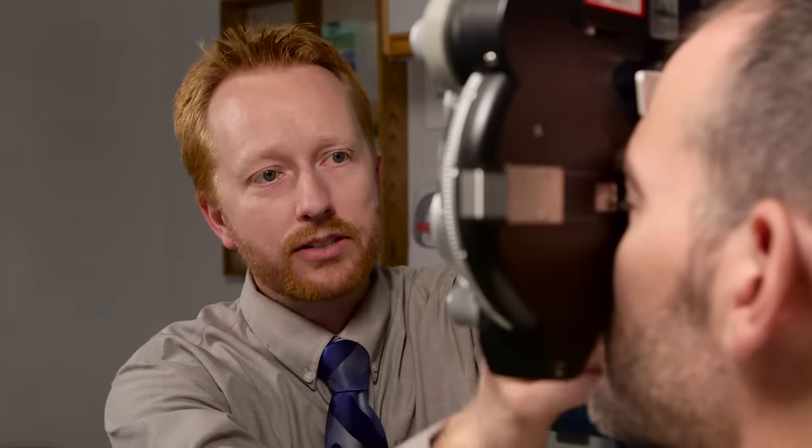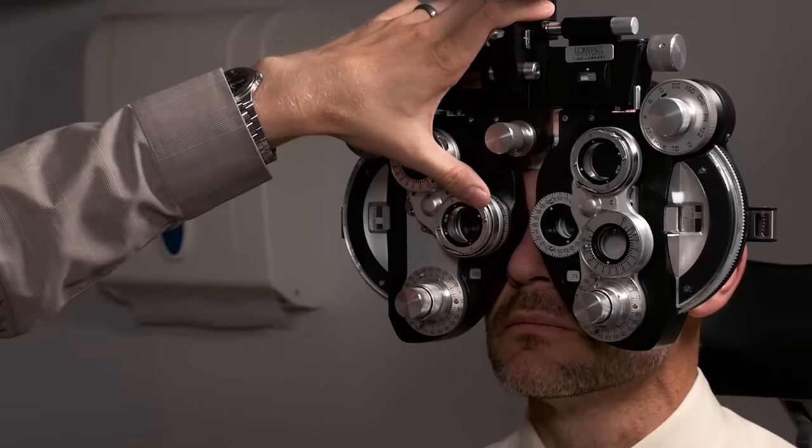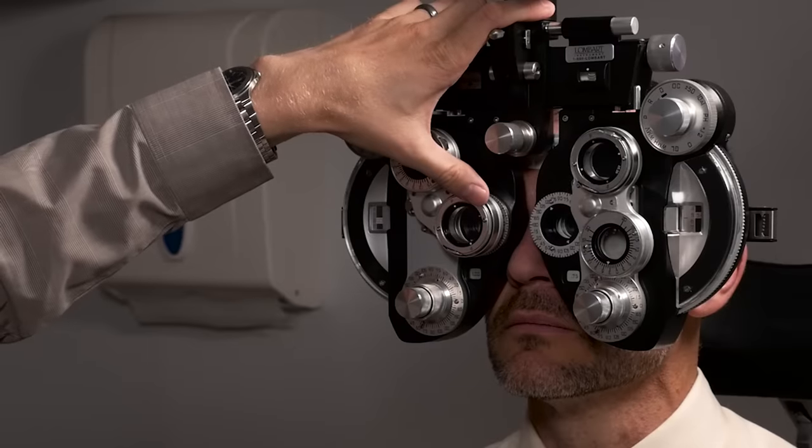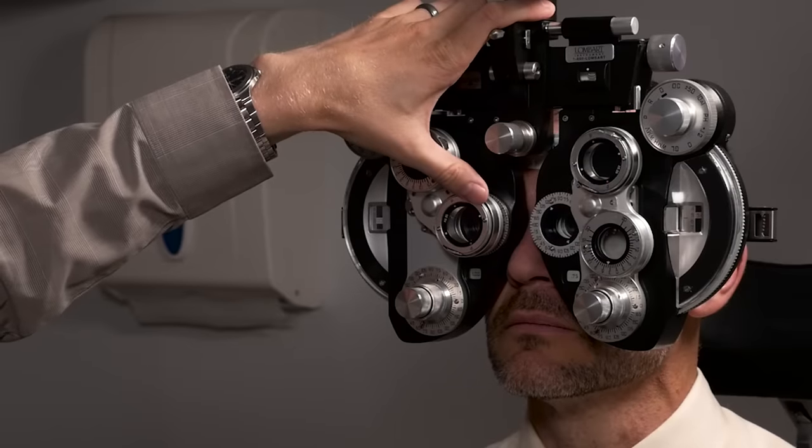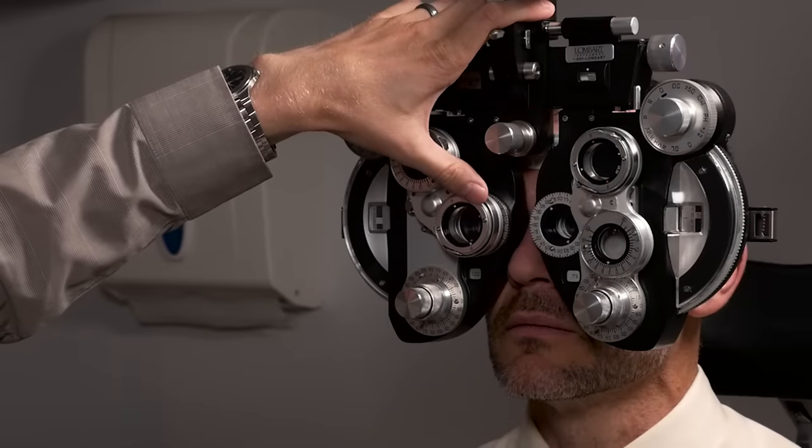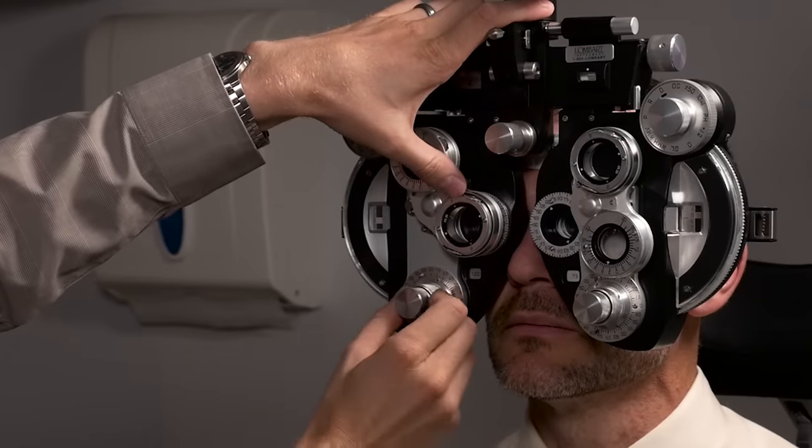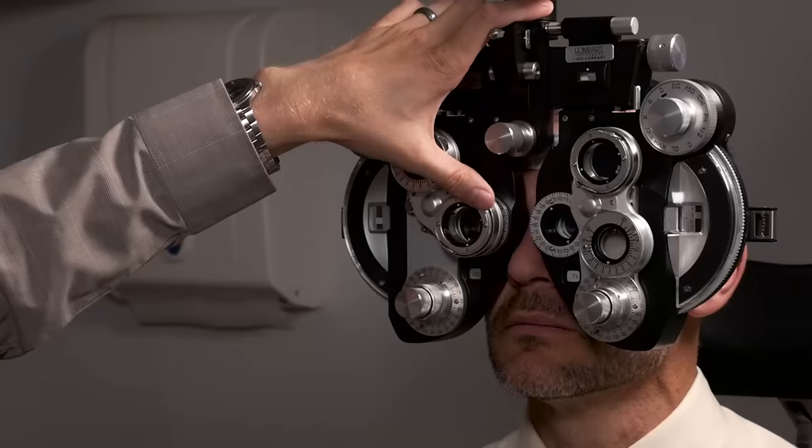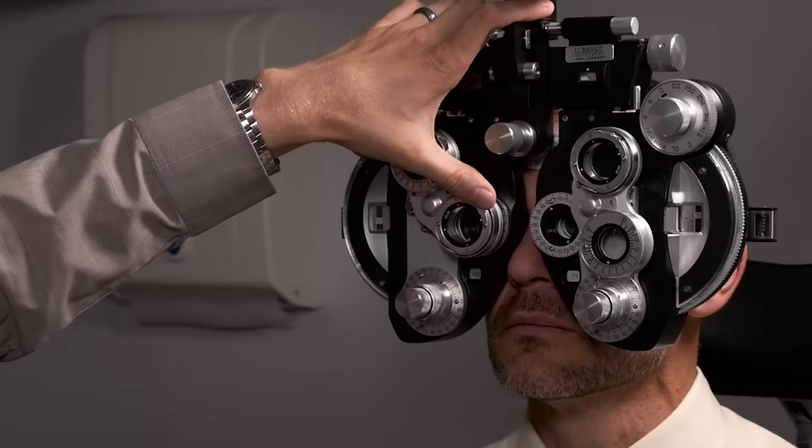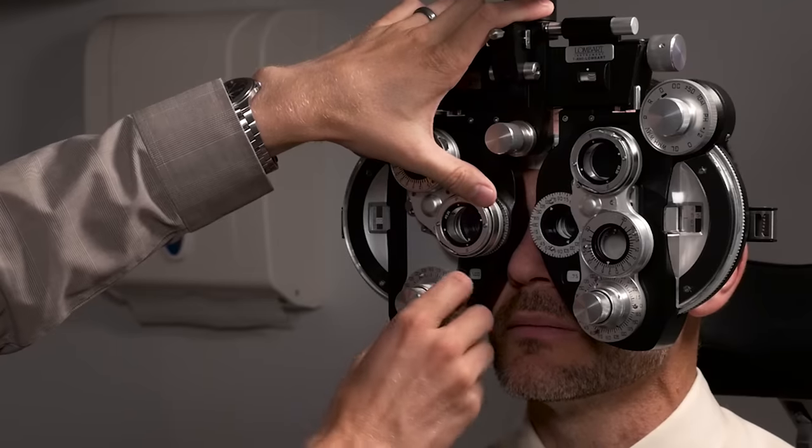So in this case I'm going to move it here and I'm going to say what's more clear? Number one or number two? We'll do it again. Number one or number two? Number two. Okay good. So I'm going to move it toward the direction of the white which is this way. I'm going to ask him again which is more clear? Number one or number two? They're about the same. Pretty close.